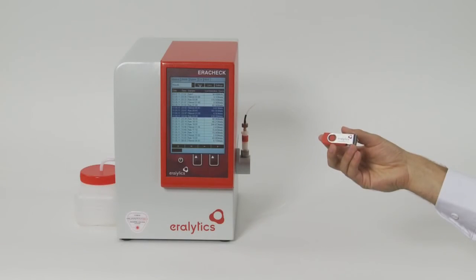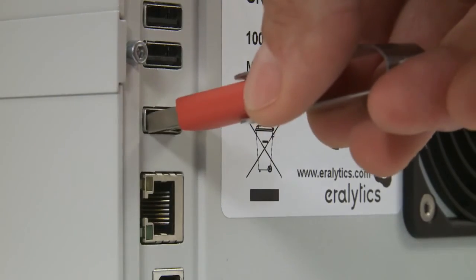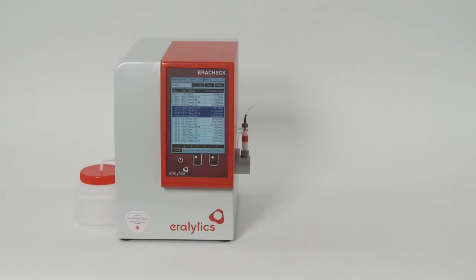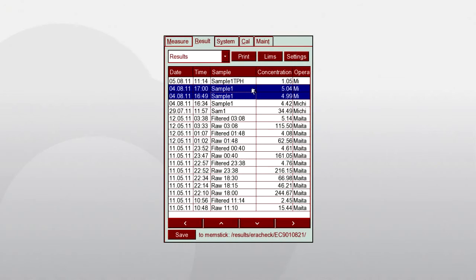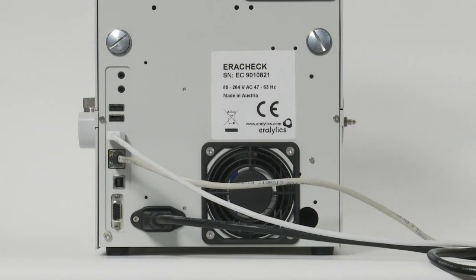A file containing all results can be stored on a USB flash drive for review in MS Excel. A very convenient alternative is the automatic transfer of data to a LIMS system — no software is required. Simply connect the instrument to the local area network via the built-in Ethernet connection and define the folder and file name where the results shall be stored.